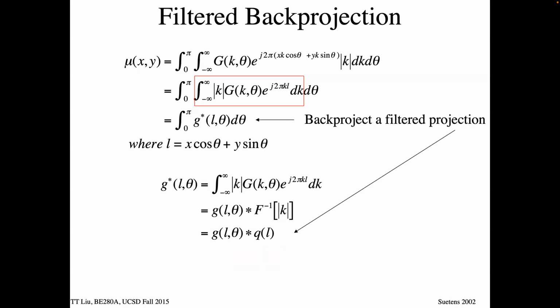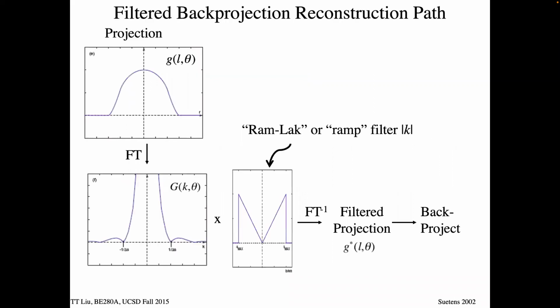And so yeah, this is called the Ram-Lak filter because of the two guys that came up with it, well, we'll see their names. I can't pronounce their entire name because it's so long. But that's theoretically what it should be. Practically, it rarely is this, and we'll see why. Because this is truncated, so in a sense there's an additional filter here, which is like, I've got to stop this madness. I'm going to truncate it, as opposed to amplifying more and more of this high frequency stuff, right?